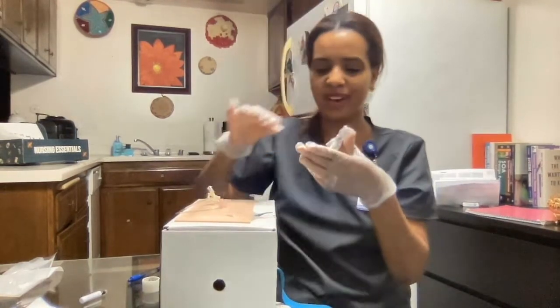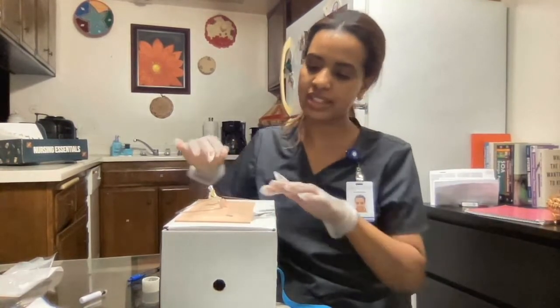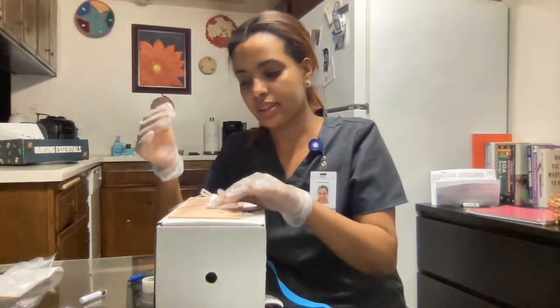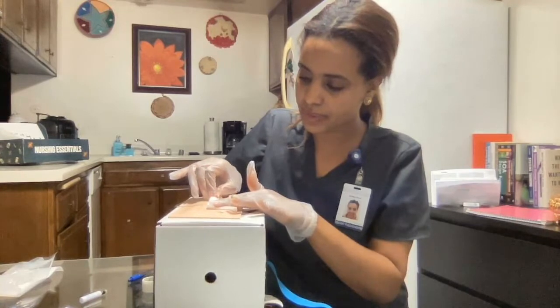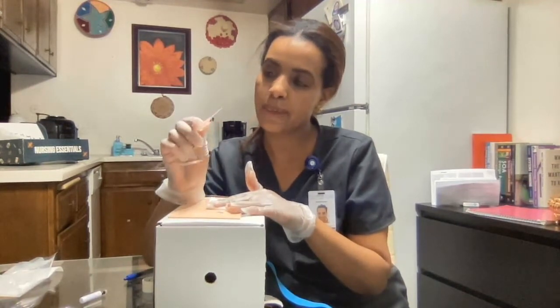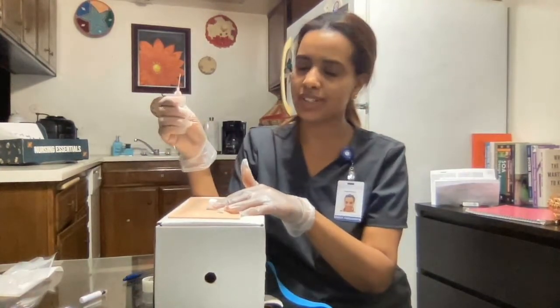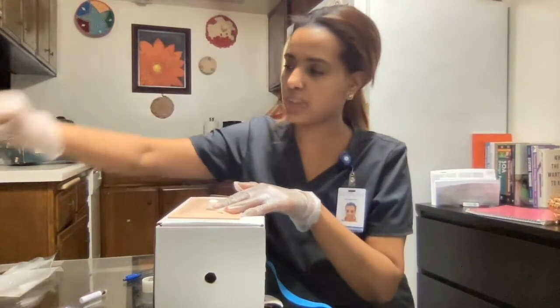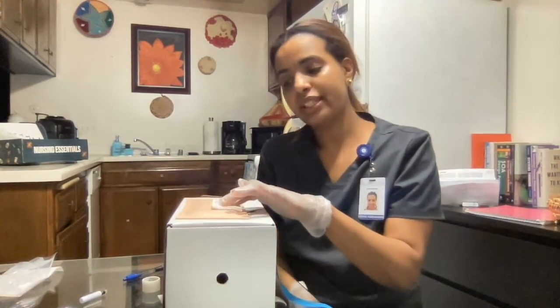Make sure you initial it, put the date, and put the gauge size. After that, make sure you take off the tourniquet. Then go ahead and take off your gloves, perform hand hygiene, and ask your patient if they're comfortable and if they need anything — also assess the skin. If the patient doesn't need anything, clean all supplies, discard everything, perform hand hygiene, and go document.